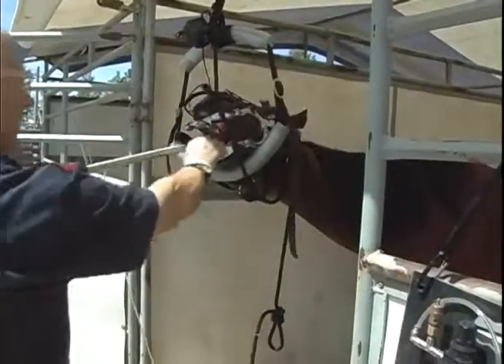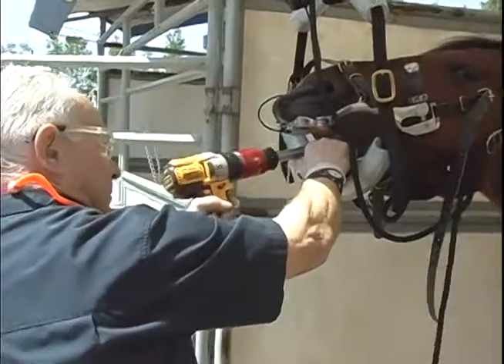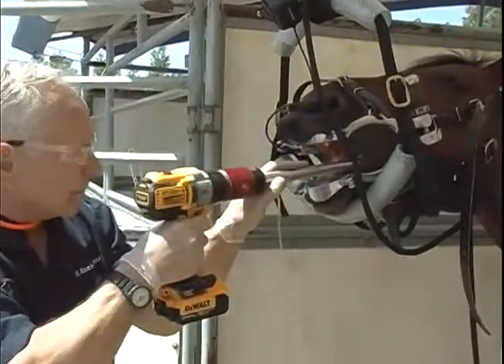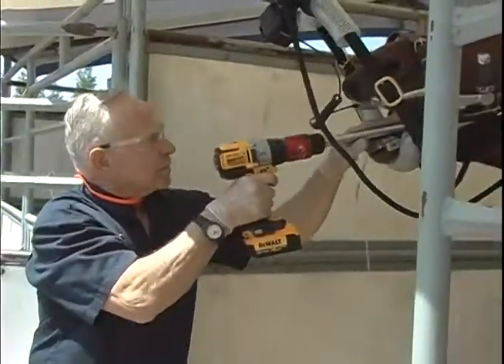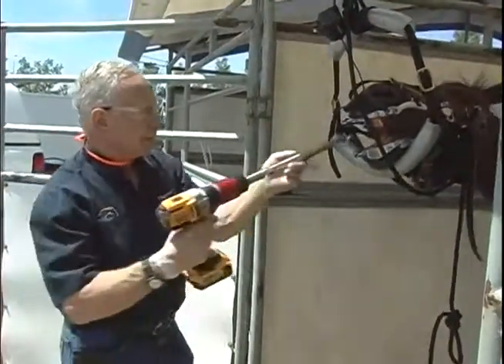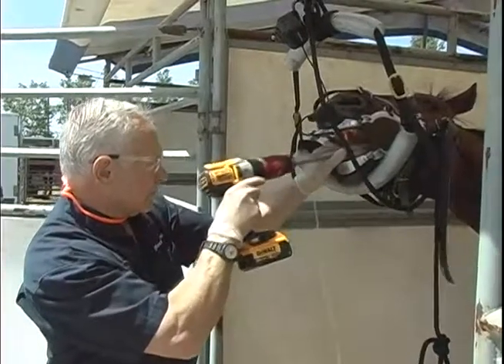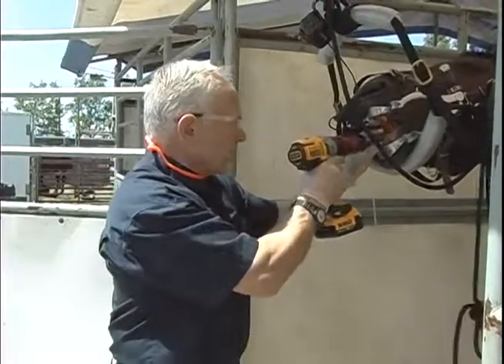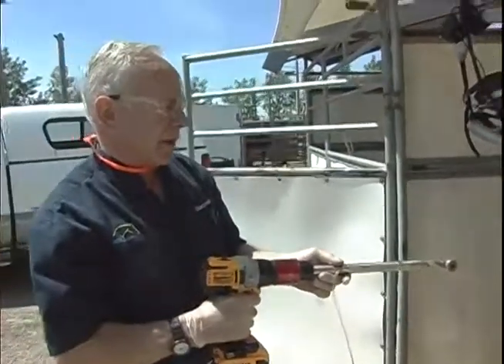I'm on this side, so I'm going to float the outside of the uppers. It'll be like this. Come across, float the inside of the lowers. Then I'll flip it. Float the outside of the uppers on this side. Pop over and float the inside of the lowers on this side. So after something like that, I'm done the sharp enamel points.